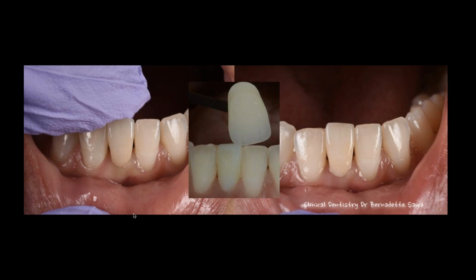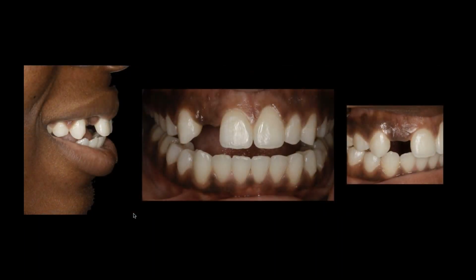So again, this photography key is kind of the biggest key for me when it comes to not only the color, but then into the communication part. And as I say, the communication part, think about when we're working on something that seems fairly simple. We're going to replace a congenitally missing lateral. Okay, we're going to make maybe a Maryland bridge. Patient can't have an implant, or maybe they're not ready for an implant at this point. And everything seems like our normal process.